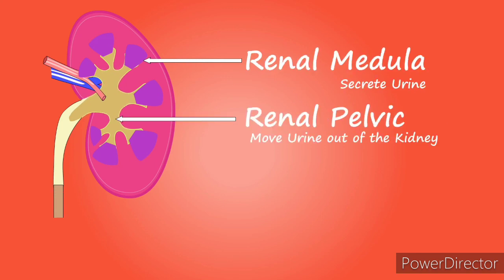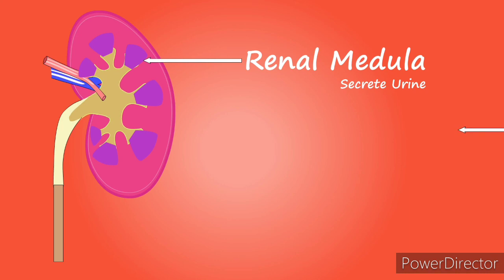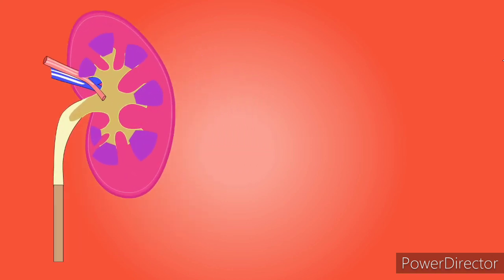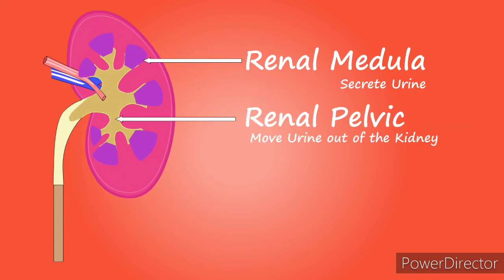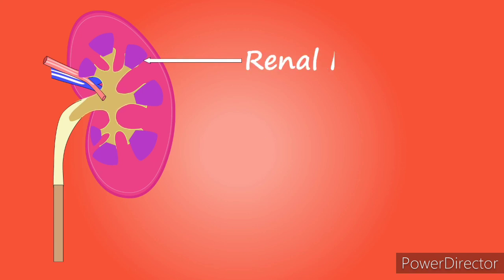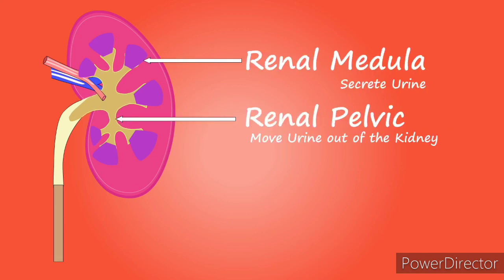That is the confirmation test for the sugar part. Then when you notice that there is blood in the urine, you have to do a comprehensive test to know if this blood is as a result of menstruation, or if there is anything wrong with the kidney. That is another thing you have to consider.